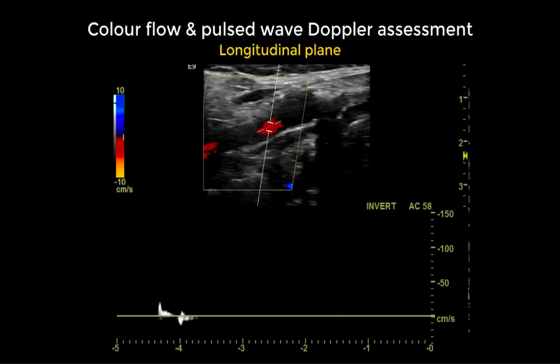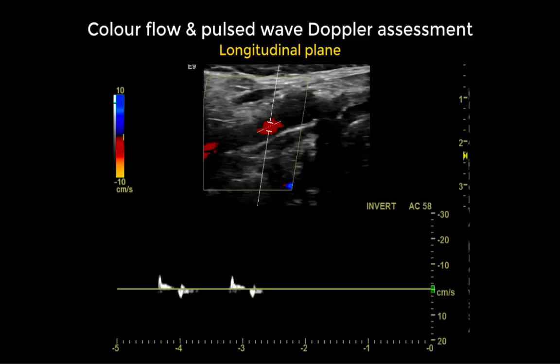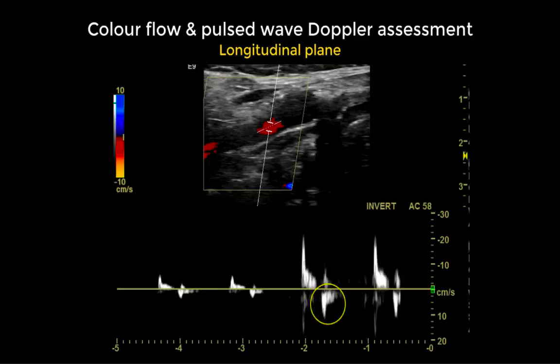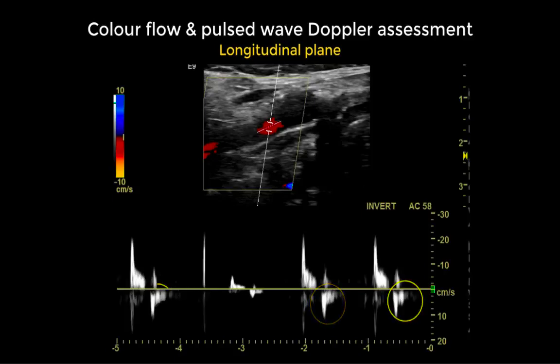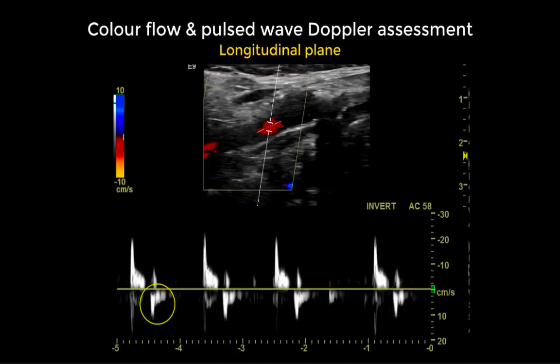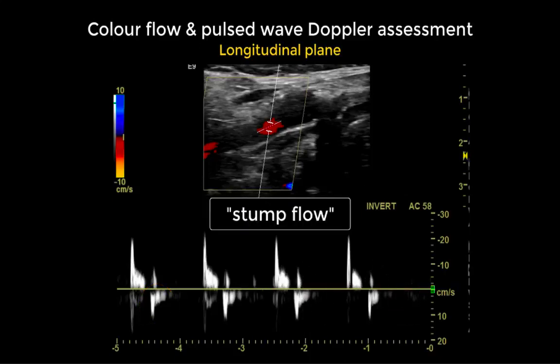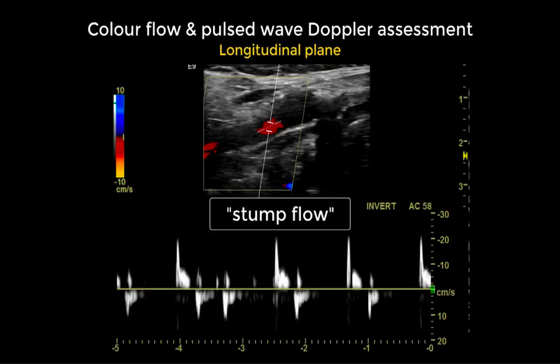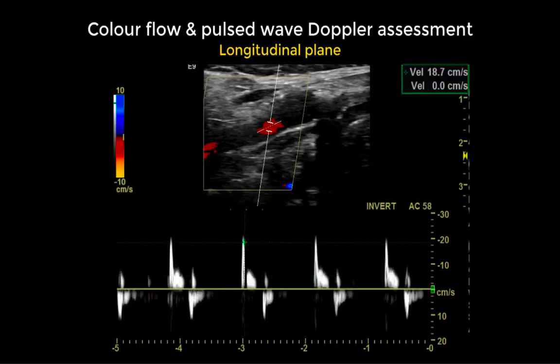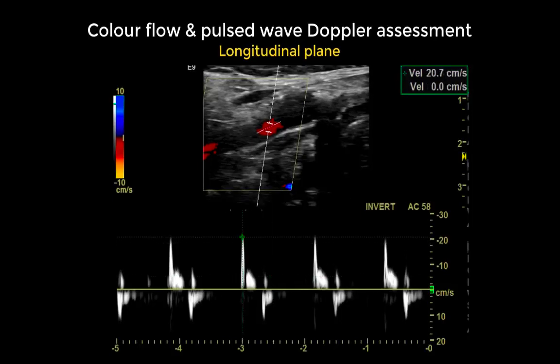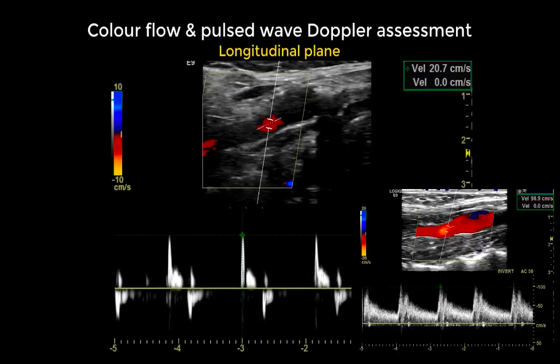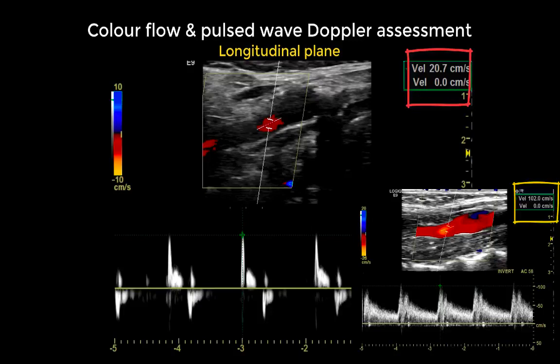We apply pulse wave Doppler again and obtain an abnormal waveform with evidence of reversal flow in late systole. This is also called a stump flow and is a typical finding in the presence of intracranial obstructive disease — either severe stenosis or occlusion of the intracranial carotid artery. Velocities are very low compared to a normal internal carotid artery, further suggesting a distal obstructive pathology.